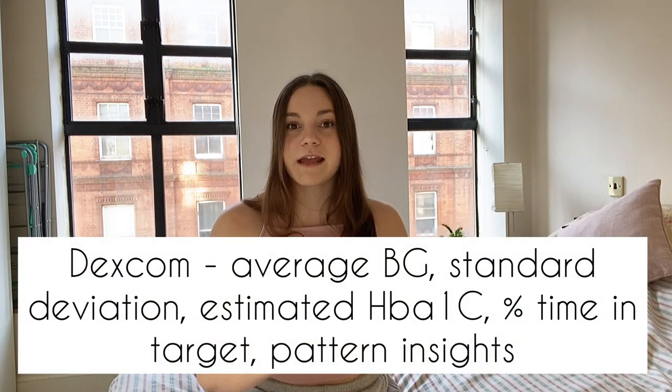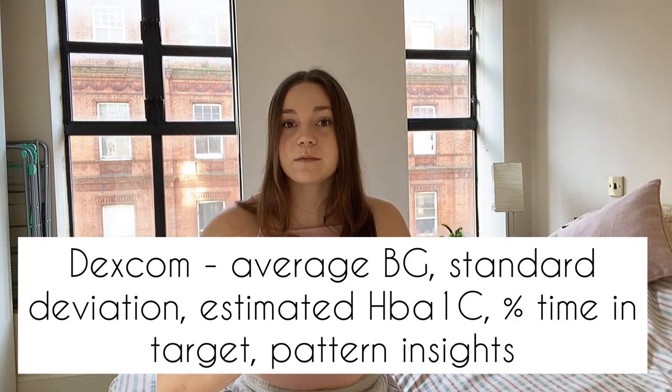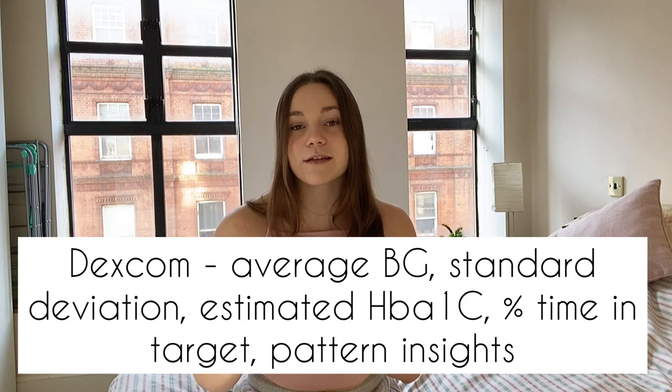Both devices show different stats. On the Dexcom it shows your average blood glucose for the day, standard deviation, estimated HbA1c, and time spent in target range. It also provides pattern insights — for example, telling you that you have highs at night or tend to go low between certain times — which is an incredibly useful feature, as I explained in my full 30-day review.